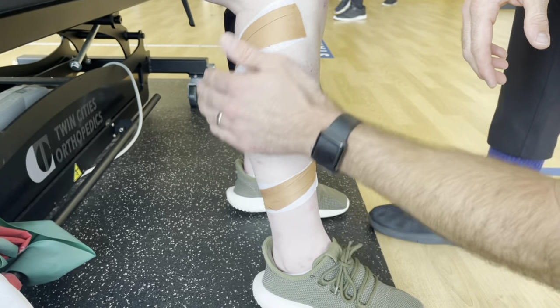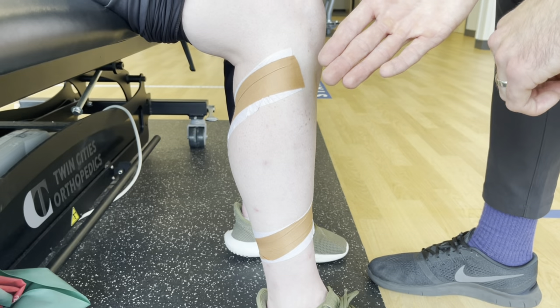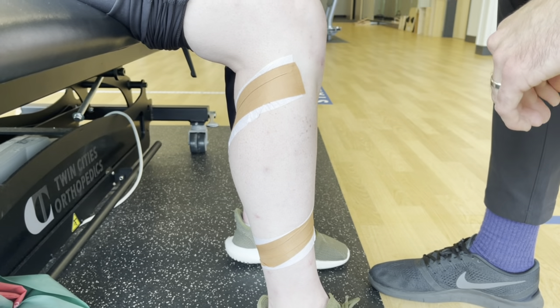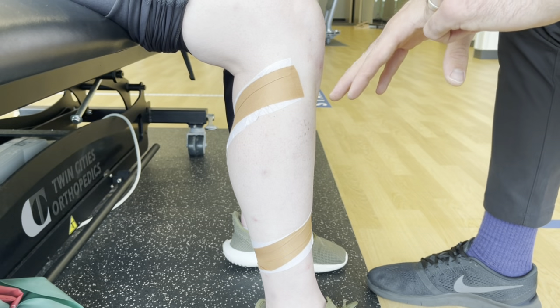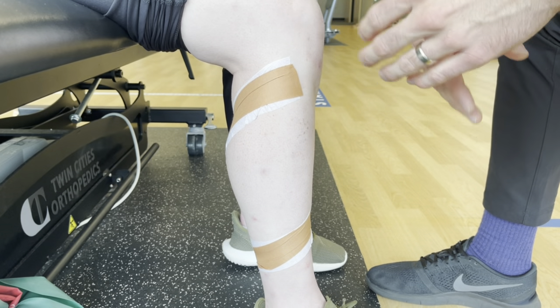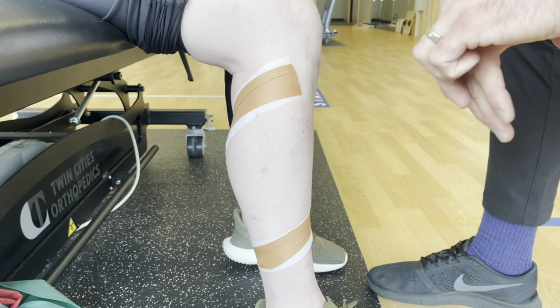Let me end it there. Typically, I'll have them do some kind of painful movement. Maybe if it's a squat — if they notice when they squat to 50 degrees and it hurts, then we tape them up and have them do the same exact squat at 50 degrees or so and rate their pain. If it's better or worse, we know if the tape worked or not.